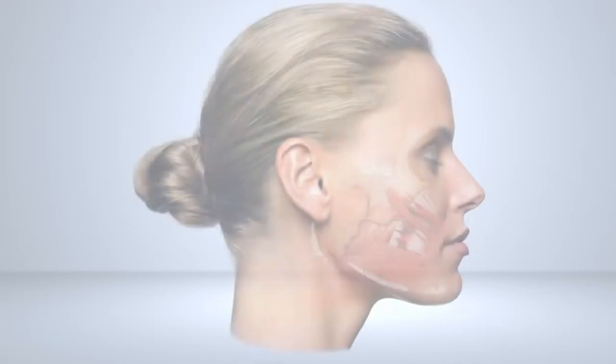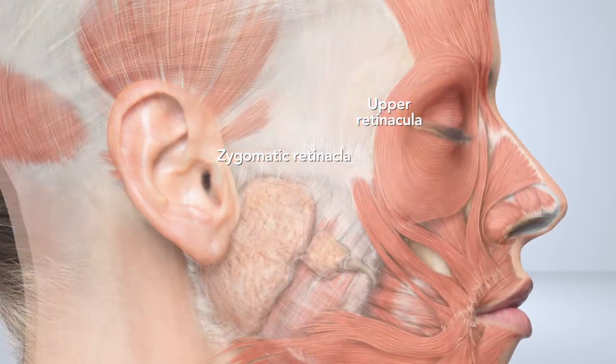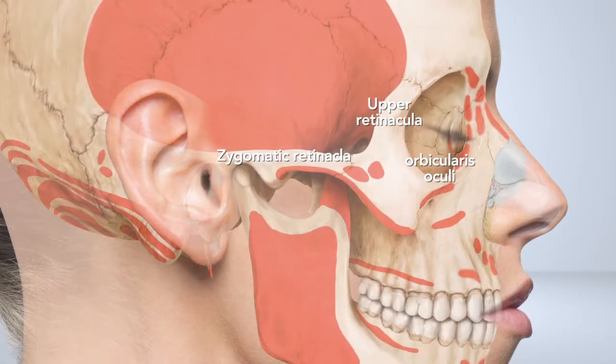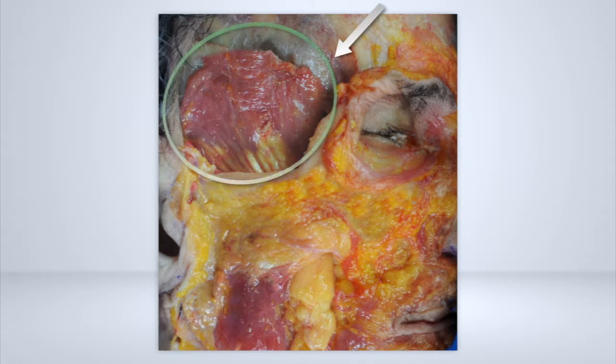The injection in the anterior part of the temple extends between the superolateral orbital edge and the hairline, and then the temporal crest of the zygomatic arch. The crest represents the upper edge of the origin of the temporal muscle. This crest is not very visible in young people. Fat loss and skeletonization create concavity, revealing signs of aging, sometimes to the point of creating an unpleasant-looking ridge at the lateral limit of the forehead.